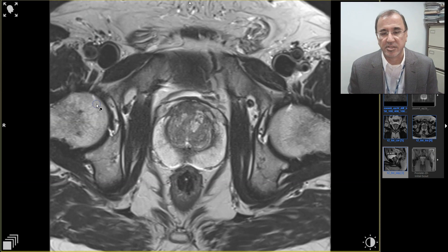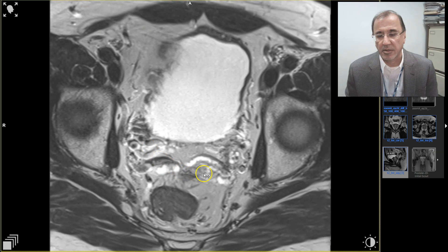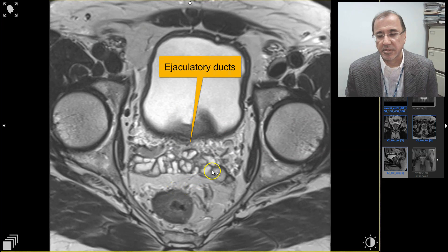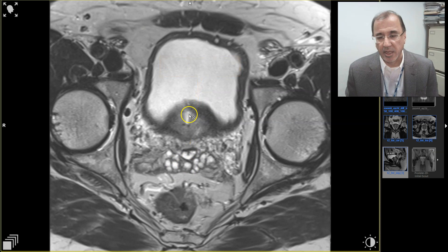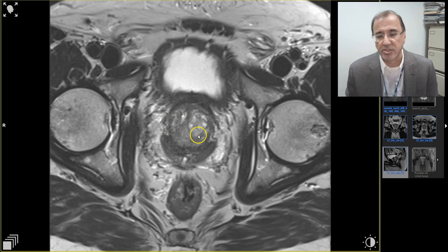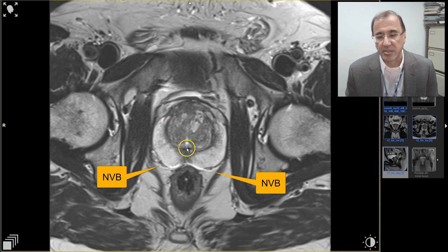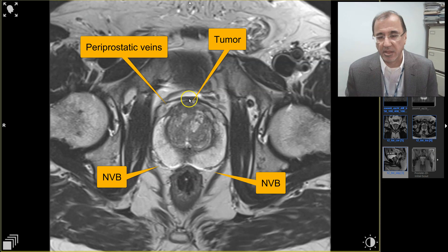Starting with the axial T2 images going from top down: we see the ejaculatory ducts, seminal vesicles, ureters, bladder, ejaculatory ducts medially, and the upper urethra. Coming down, the transition zone appears along with the central zone, the hyperintense peripheral zone, some BPH, and the verumontanum. Here is the end of the central zone, the peripheral zone, periprostatic veins, and this is the primary tumor — quite difficult to see.